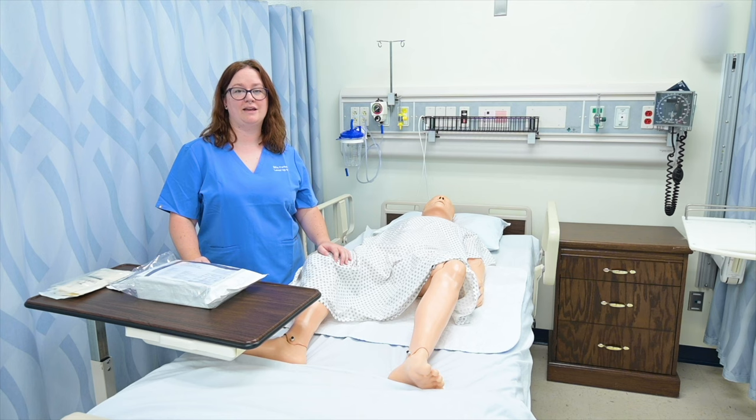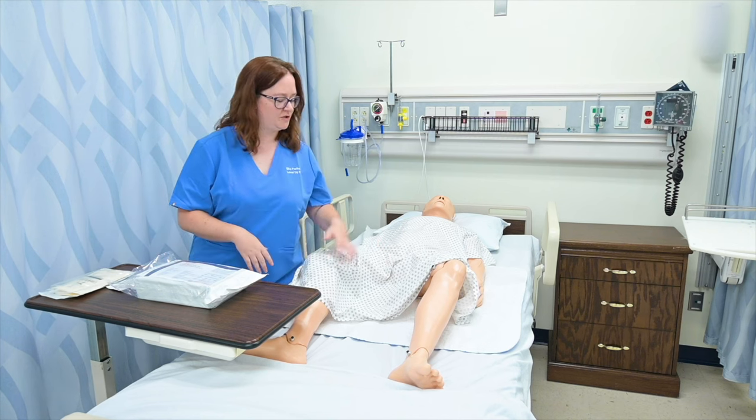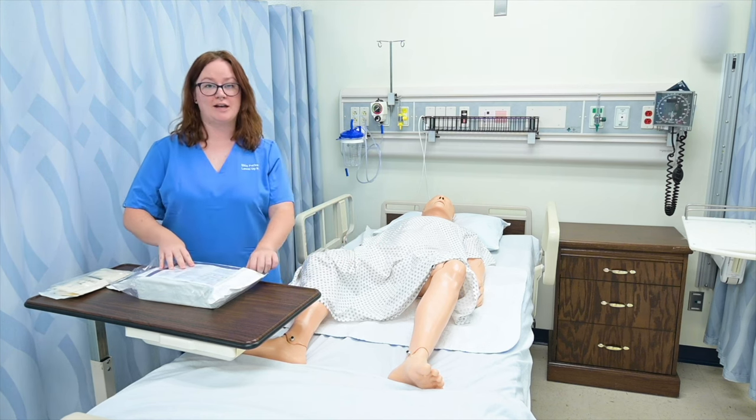To prepare to insert a catheter on a female patient, I need to have positioned them in a dorsal recumbent position, which just means to spread their knees open — we call it the frog leg position — so that we have access to their urethra. And then I'm going to go ahead and open my kit.